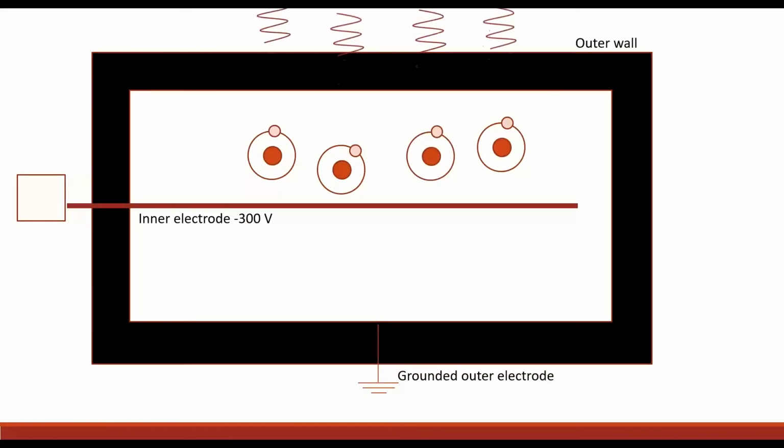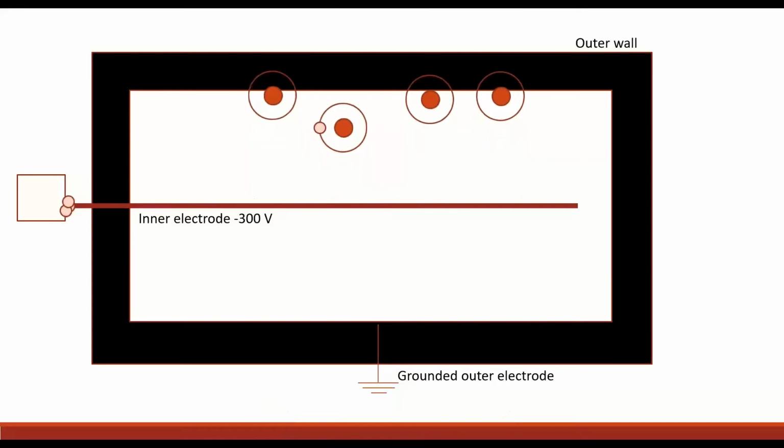When the dose rate is high, there's a higher chance that the liberated electrons recombine with a recently ionized air molecule before they make it to the collecting electrode, and this results in an under-response at the electrometer. We can account for this effect through a correction factor called P-ion, which is measured using a two-voltage method, and we will go over that in more detail later.